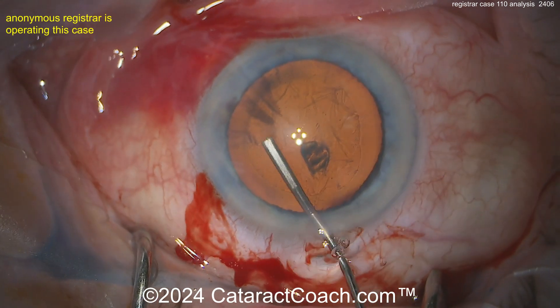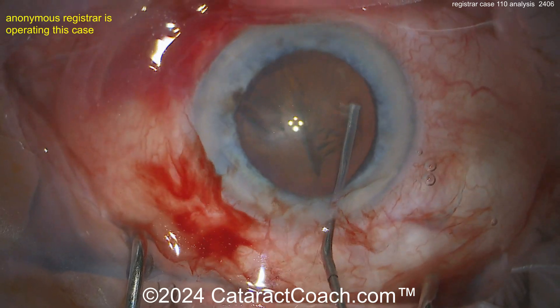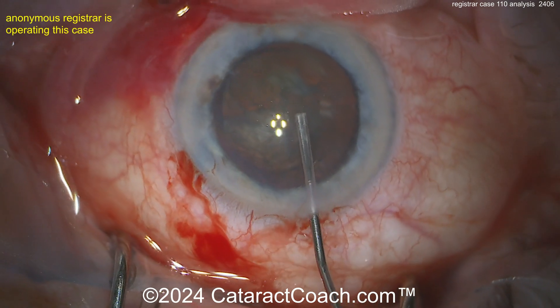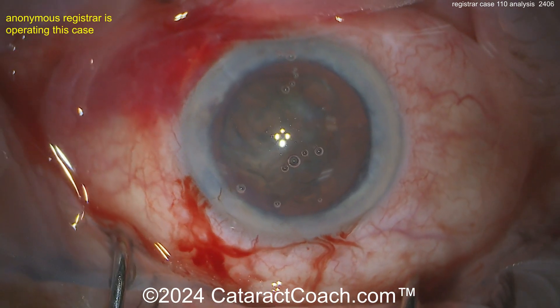Burping out a little viscoelastic. Here comes a specialized cannula to get some hydrodissection. We lost some more viscoelastic — that's okay. There's the nucleus. Let's see: does it spin? If it does not spin, you will not win. But it's spinning — you're going to win! Looking pretty good.